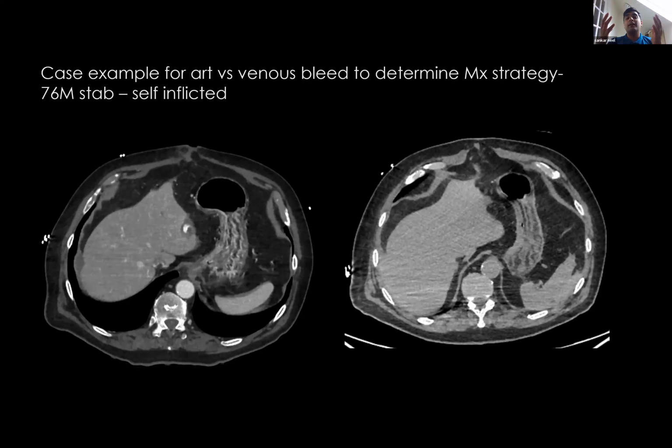So it can rupture and hemorrhage, especially something that's on the subcapsular aspect, which means that the only area it's going to hemorrhage, sort of blow out into, is the peritoneum, and that can cause torrential bleeding, right? This can also be a venous lake, right? This could be a portal vein that's been slashed peripherally, and this could be a potential venous lake.